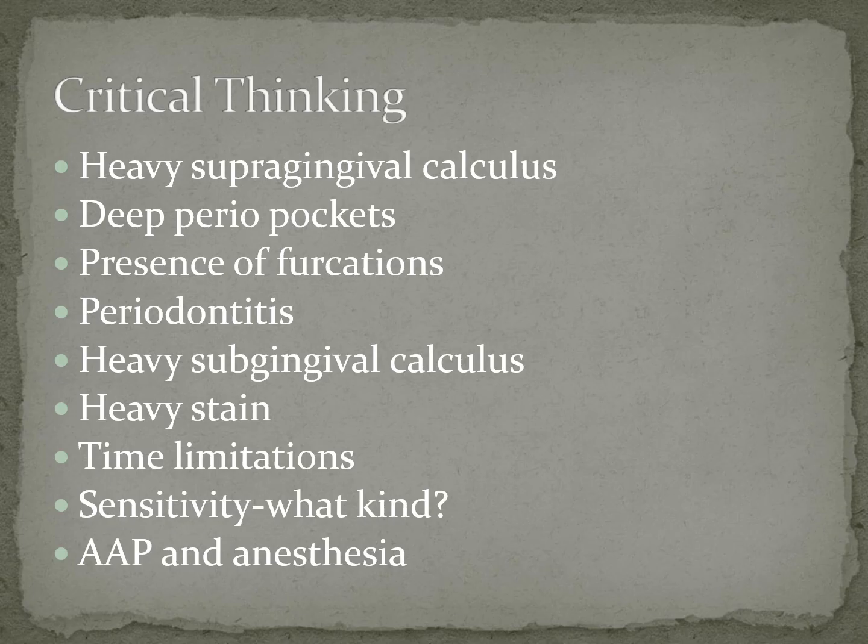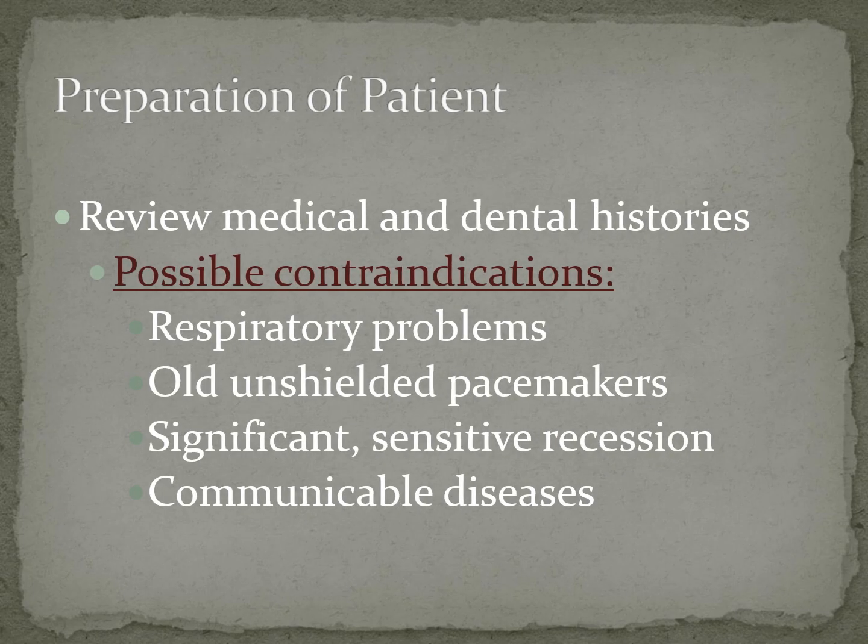If they're sensitive, we need to figure out why they're sensitive. Okay, so are they sensitive because of water temperature? Are they sensitive because of power? And do they need anesthesia? So do we need to get them numb before we use the ultrasonic scaler? Okay, so how do we prepare our patients?